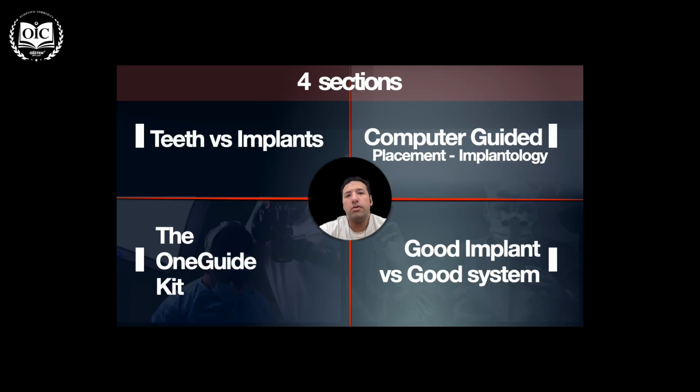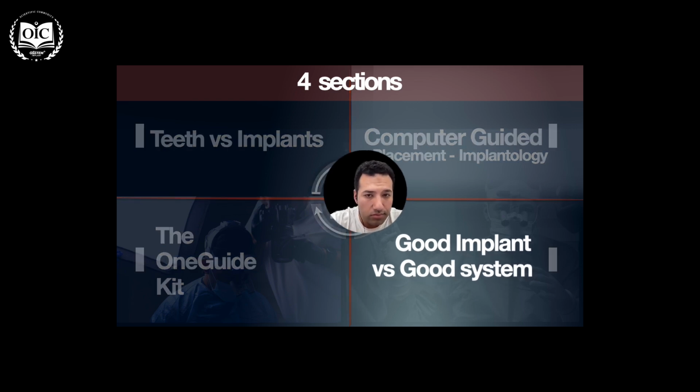Back to our common slide, the 4 sections of the presentation. We finished number 1, number 2, and now time for number 3, a good implant versus a good implant system.